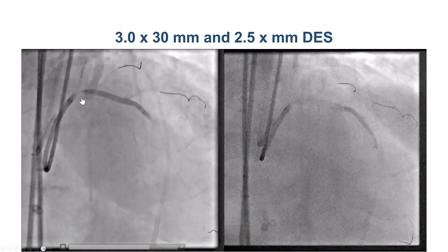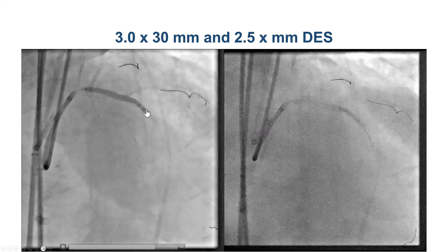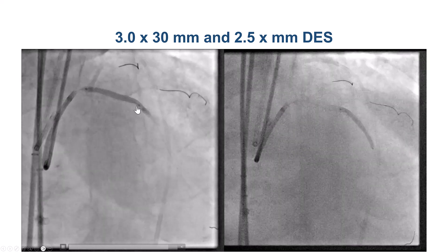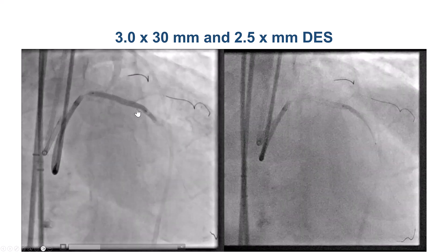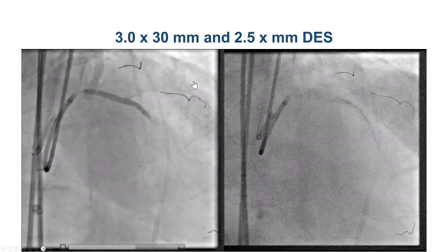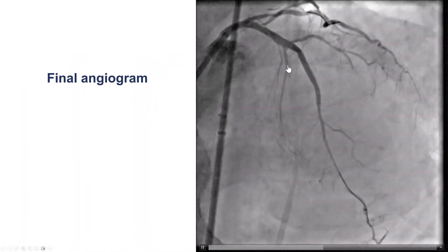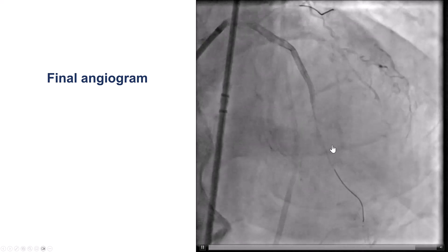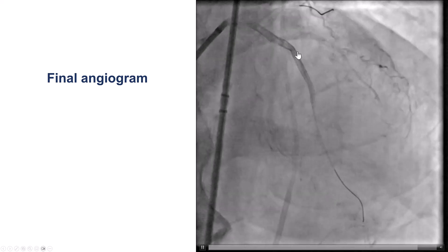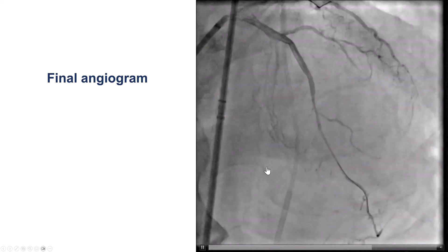We then covered it partially with a drug-eluting stent, both to cover the CTO and to potentially decrease the risk of restenosis within the covered stent. There is still an area of slight underexpansion, but obviously this was not the time to attempt high-pressure inflation given what had happened. The final result is fairly good: there is TIMI 3 flow into the LAD, we still have flow into the second diagonal so the covered stent did not occlude its origin, and we still have the major septals.